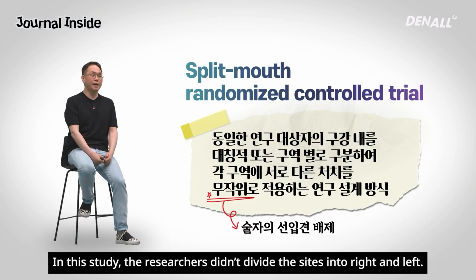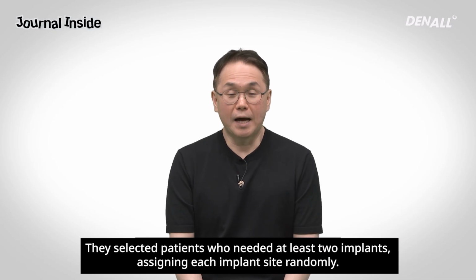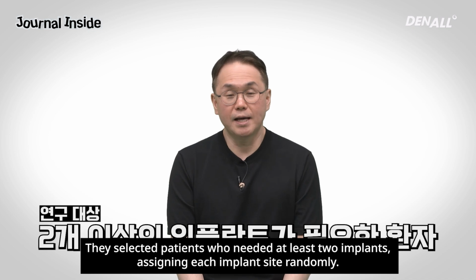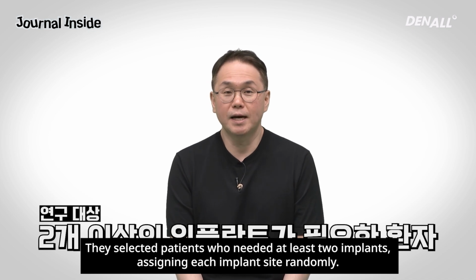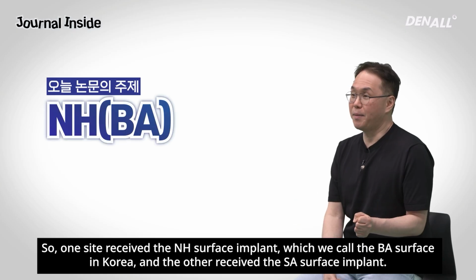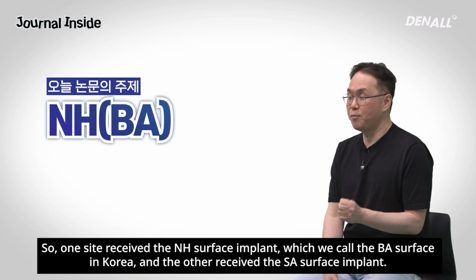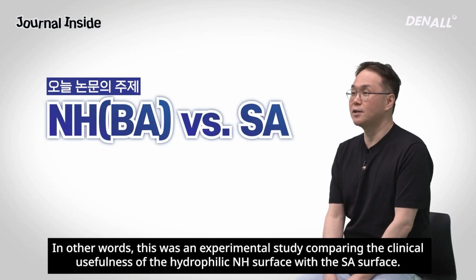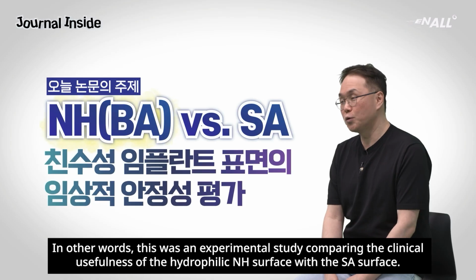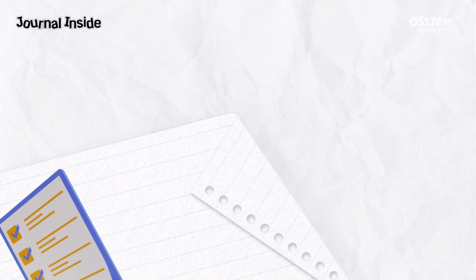In this study, the researchers didn't divide the sites into right and left. They selected patients who needed at least 2 implants, assigning each implant site randomly. So one site received the NH surface implant, which we call the BA surface in Korea, and the other received the SA surface implant. In other words, this was an experimental study comparing the clinical usefulness of the hydrophilic NH surface with the SA surface.